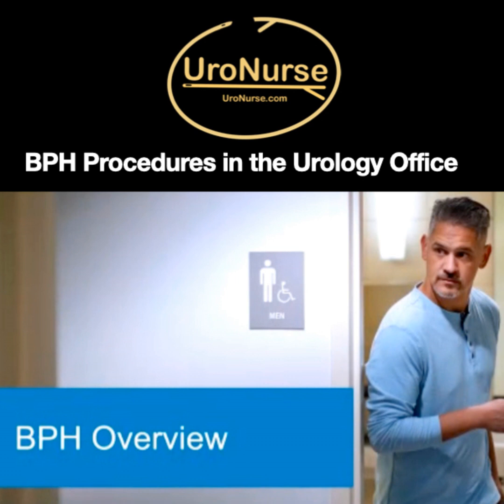And with the chronic retention patients, and I've seen this with both Urolift and Rezum, I don't know why some patients get this. Obviously, the more treatments and the more edema, they are more prone to it. I try to transition these people to intermittent catheterization if possible. But obviously, you got to pick the right patients for that.